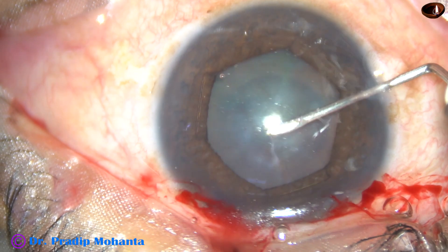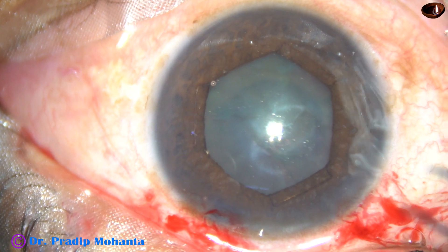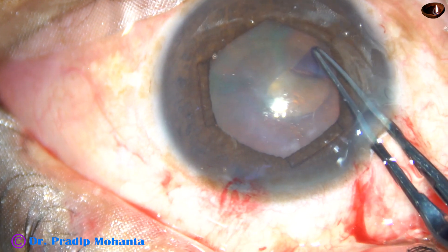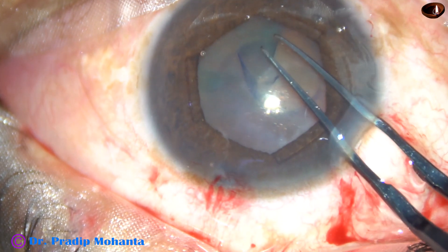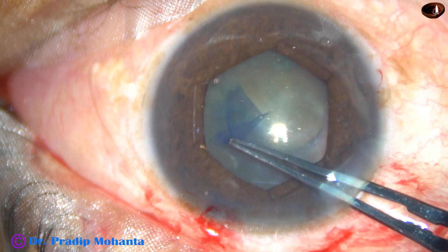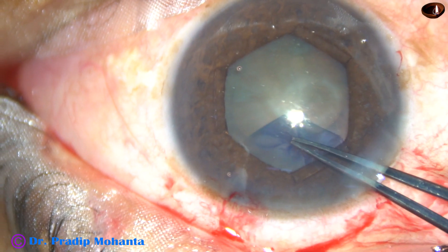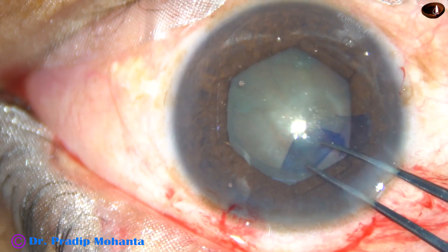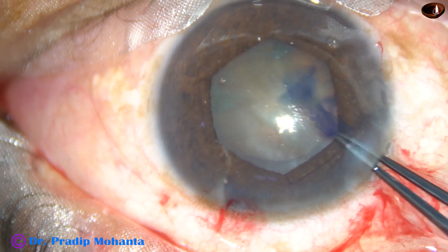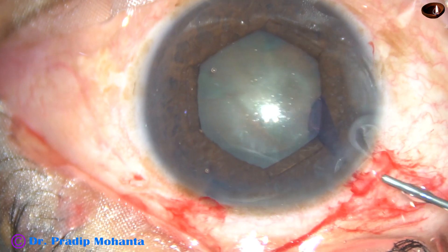This is a 26-gauge bent needle cystotome and this is a Utrata forceps. See how comfortably you can do the rhexis. We have to go very close to the margin of this dilated and expanded pupil to get an adequately sized rhexis. I have got a rhexis of about five millimeters.